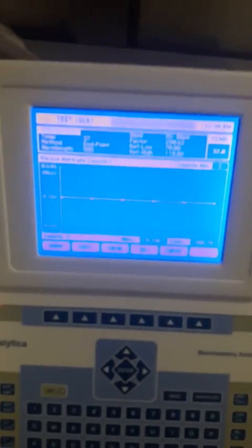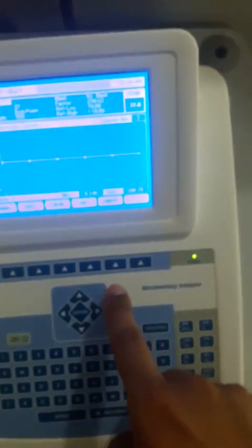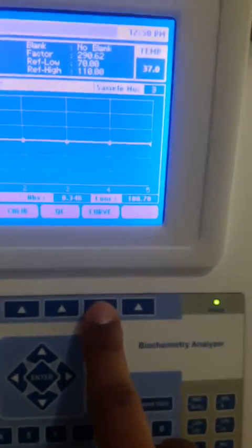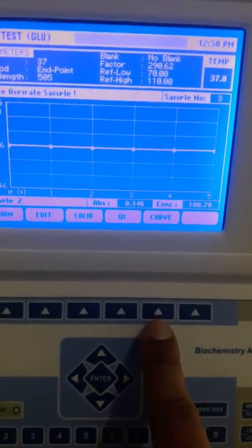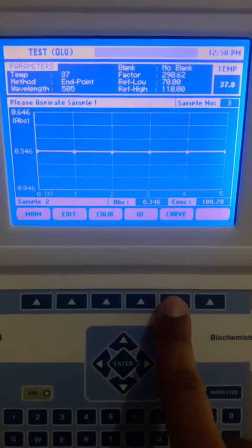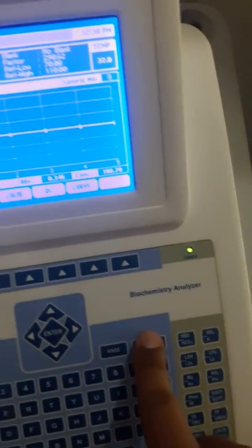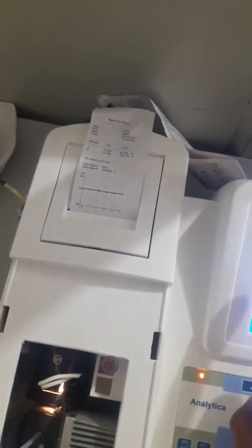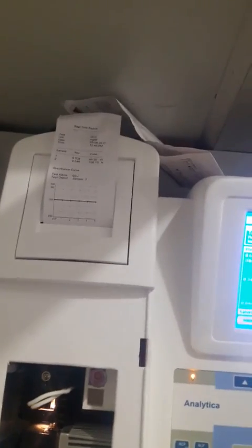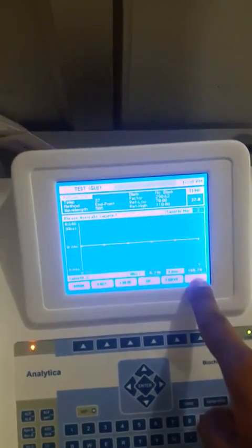This is how we can perform the glucose test. We can also print this graph on the thermal paper. To print the graph, we have to press the Curve key. You can see the curve — it is showing the graph representation of the recently performed glucose test. This curve is for the second sample whose concentration is 100. By this method we can perform the test. Thank you.